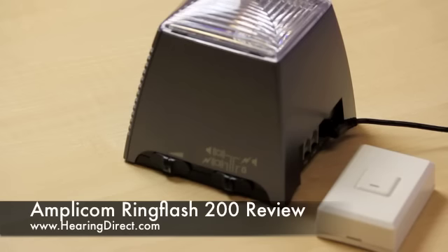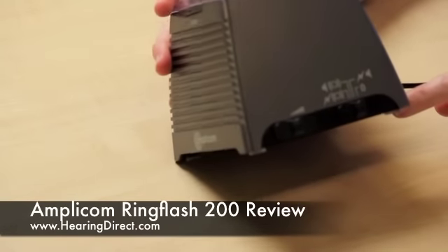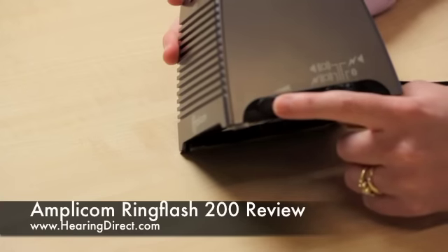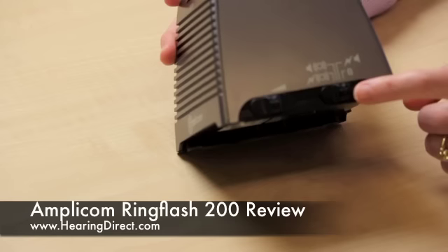Once the power has been plugged into the actual unit, you can then test to see that it is working as well. If we move this around so that you can see the various things you can change — there is a volume slider that you just move up and down, and then this switch will allow you to choose how you want to be alerted.